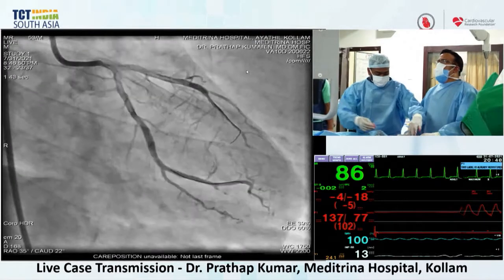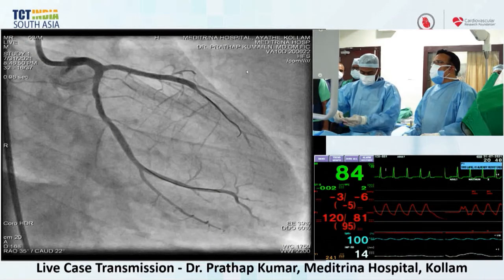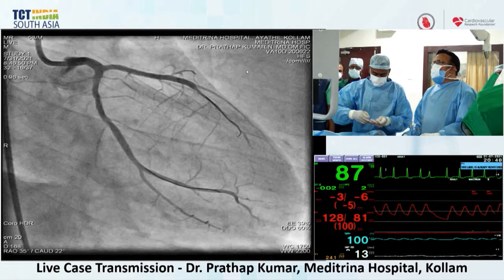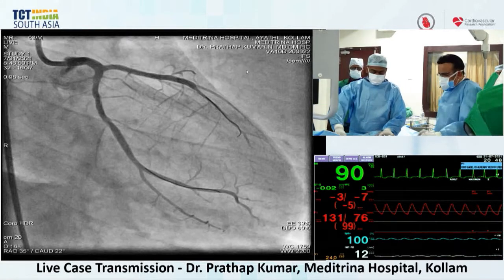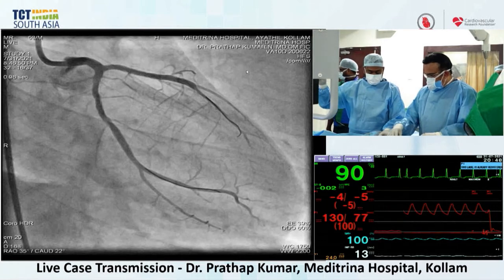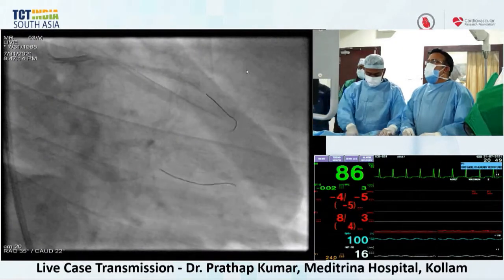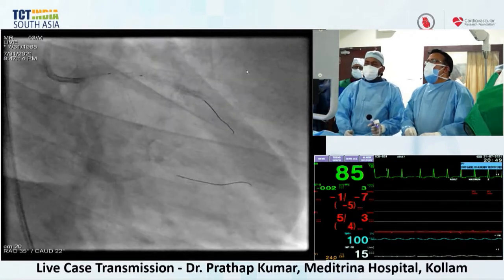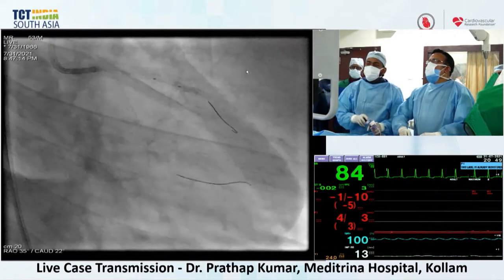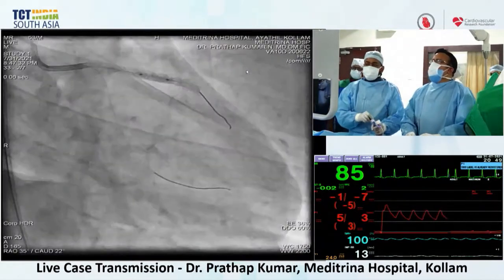So here, that's interesting, right? You have a stent up now, and you still have a fair amount of competitive flow distally, which is unusual when you have a totally recovered lumen in the target vessel. It is possible actually, Sanjog. It may take some more time, because the collateralization was wonderful in this case. You could see multiple collaterals, and even though the patient had angina, the collateralization was very good. So this is one of those perfect opportunities where, if you had a guide in your retrograde donor vessel and you put a balloon up inside that LAD stent and occluded it, you could take a picture and figure out how far that flow comes up. If that flow doesn't come up, then you're dealing with distal embolization or a dissection or something.